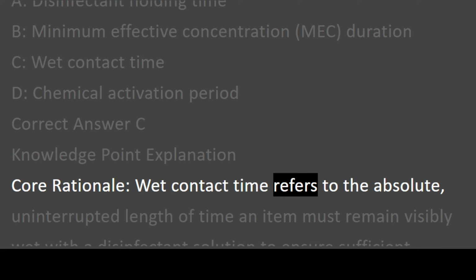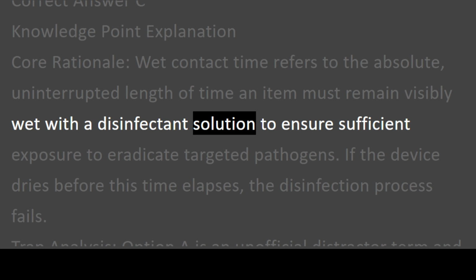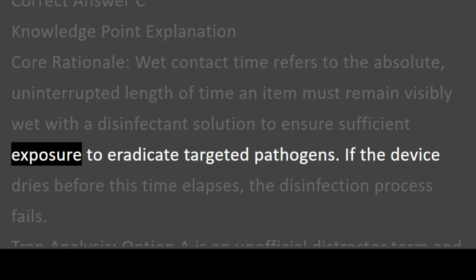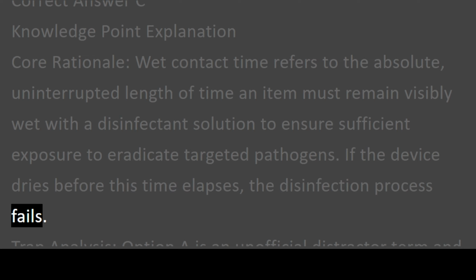Wet contact time refers to the absolute, uninterrupted length of time an item must remain visibly wet with a disinfectant solution to ensure sufficient exposure to eradicate targeted pathogens. If the device dries before this time elapses, the disinfection process fails.